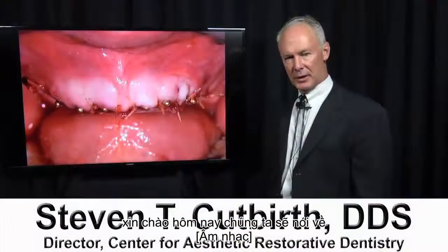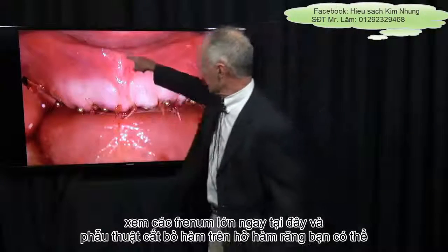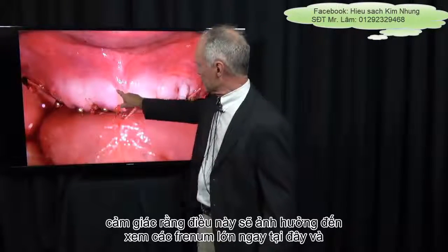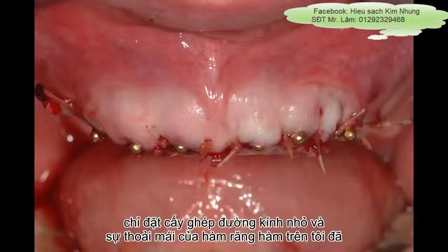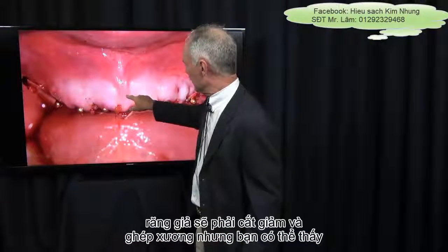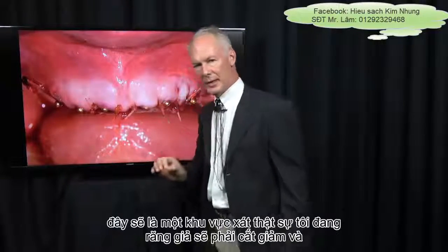Hello, today we're going to talk about maxillary anterior frenectomy. You can see the big frenum right here, and the feeling was that this would affect the comfort of the maxillary denture. I've just placed small diameter implants and bone grafted, but you can see how far the denture would have to be cut back, and this would be a real rubbing area.